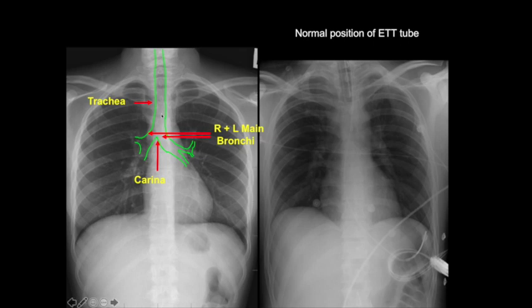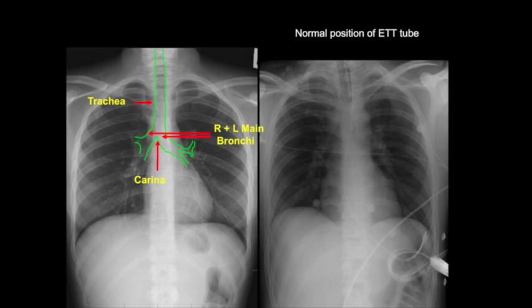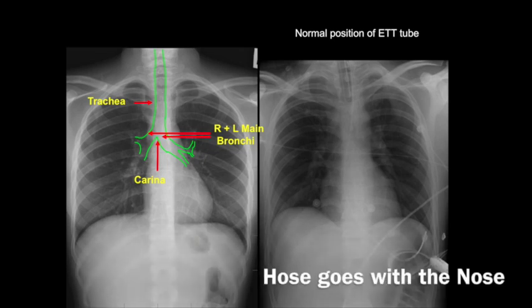This is an outline of the trachea, the carina, right and left main stem bronchus. The endotracheal tube should be five to seven centimeters proximal from the carina. If the patient flexes or extends their neck, the position of the endotracheal tube will change. If they flex their neck or put their chin down, the tube moves down. If they extend their neck or move their chin up, the tube moves up. The way you remember that is: the hose goes with the nose.